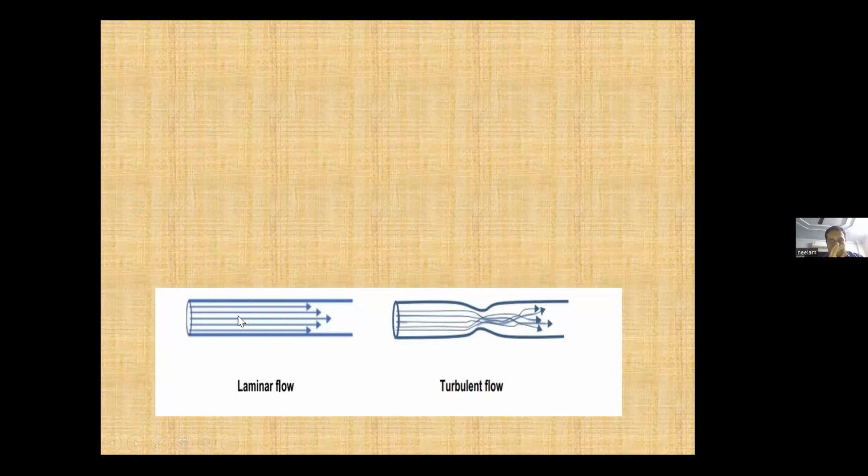That is, there will be a laminar flow. But as soon as you increase the flow a lot, suppose I intubate a child and keep a flow of 16, 18, I can keep that much, but why don't we keep it? Because as soon as we increase the flow too much, all the gas molecules will become turbulent. So the flow which is laminar now will become a turbulent flow, and once it is a turbulent flow, the resistance will increase. So that is one concept.